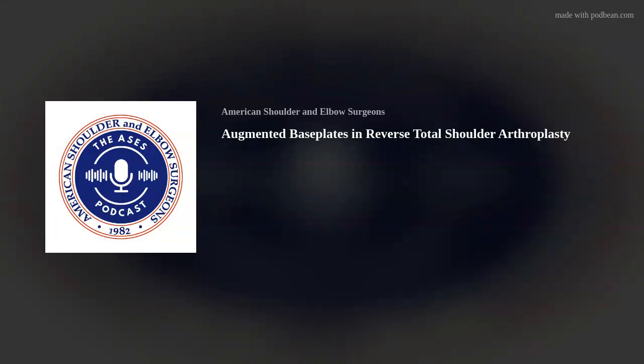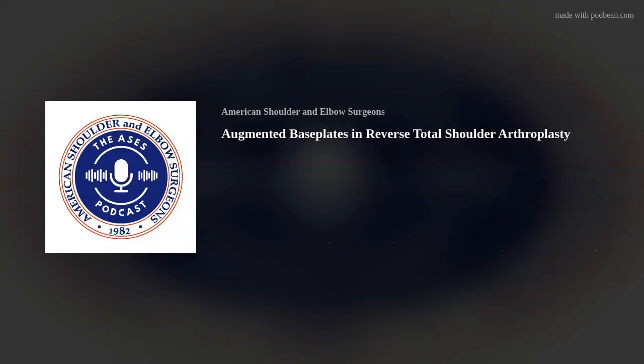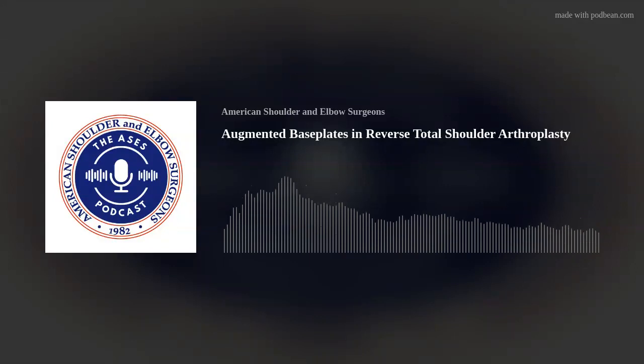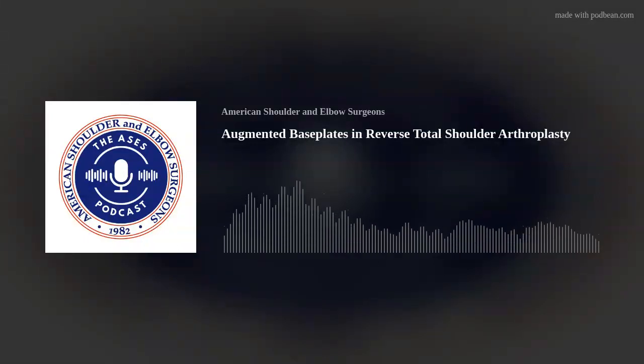The version doesn't concern me so much. They're usually fairly inverted. The baseplate's fairly inverted in these situations. And so, once you've, hopefully based on your preoperative CT, figured out whether you have bone in that confluence of the spine, the coracoid and the scapula, and if you have enough bone there, then I think what you want to do, and if you haven't done this before, having fluoro is not a bad idea. It's just going to give you an idea of your height, not necessarily if you're in the right spot.